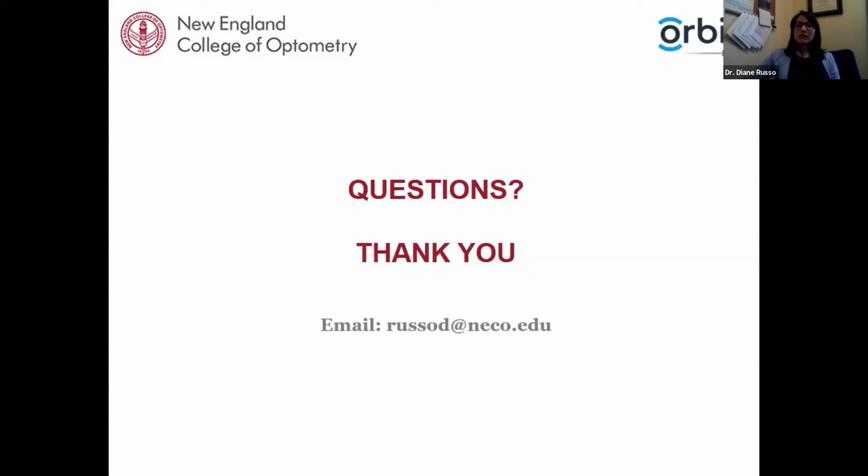The more skilled the examiner is at performing retinoscopy on very young children, infants, between infancy and around age 2, the accuracy of retinoscopy is going to be much more impacted by the skill of the examiner than the age of the child at that point. So it should be fairly accurate if the examiner is experienced in working with young children.